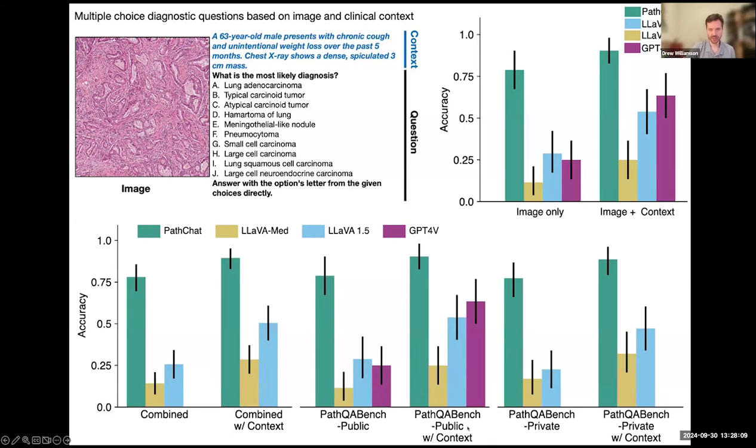Also important to note that in our model and, to our knowledge, at least both the LLaVA 1.5 flavors that we tested, the TCGA publicly available images were never in the training data set. And so our pre-trained image encoder that takes images and projects them to that sequence of floating point numbers didn't have TCGA images in the training data. But we have no idea about GPT-4V.